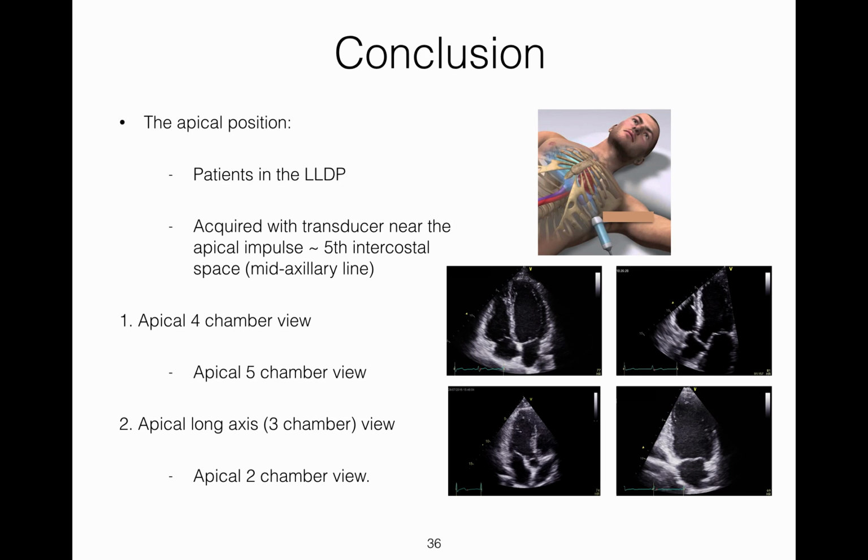Apical imaging was part 2 of the lecture. Patient positioning, transducer positioning and orientation and image orientation for the different apical views was discussed, together with ways to adjust apical imaging for different measurements and imaging applications.